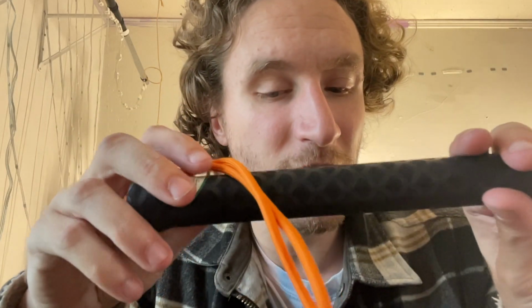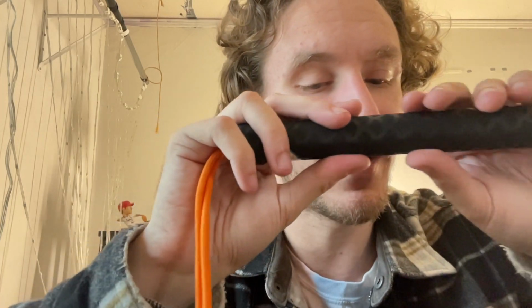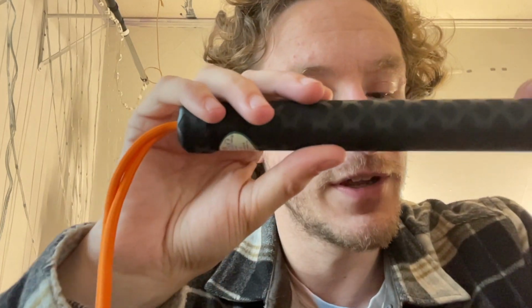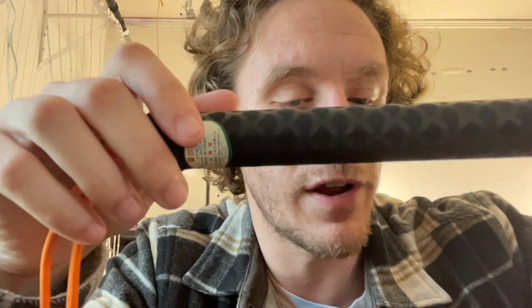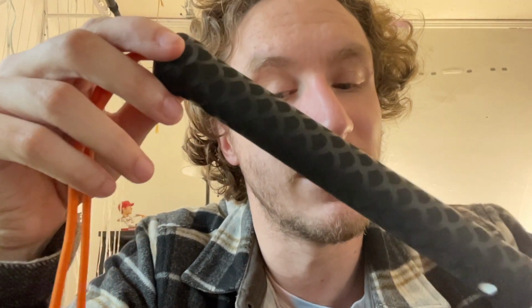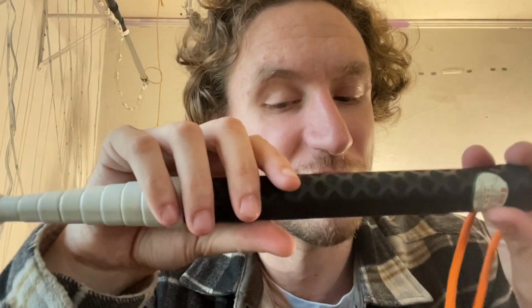Now, the odd thing about this cane is that it's actually not circular. If I put it down on the table next to me, it doesn't roll exactly. Maybe once and then it settles. Sort of shaped like a pencil, in that it has 4 sides, each of which are kind of on a square. And as I rotate the cane, if you can see, you'll be able to see the differences. This grip also has a texture to it.